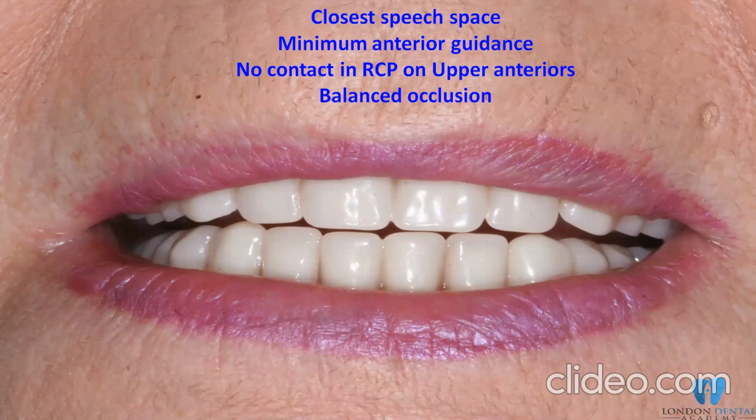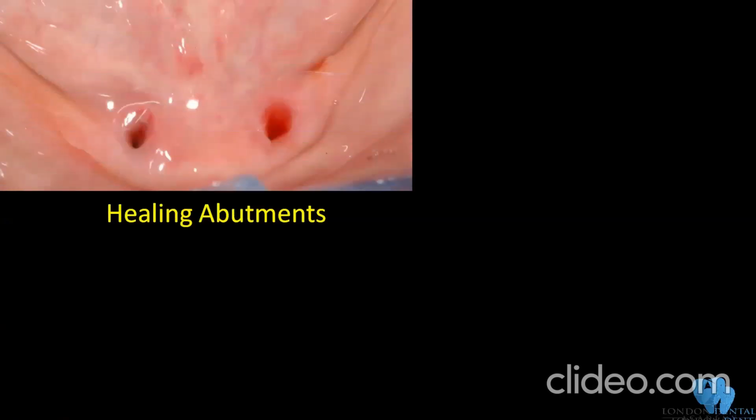So sometimes you come across cases where you have thick soft tissues. And again, just to let you know, sometimes if you remove the healing abutments, you will find yourself in a very difficult situation. Probably the locator abutments can be maximum 5 millimeters, but sometimes you need 7, 8, 9 millimeters. Then you need to change the strategy.